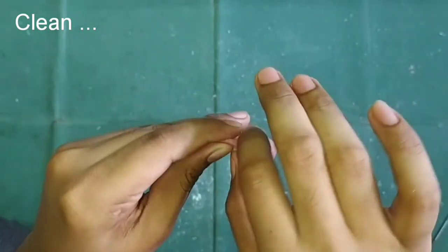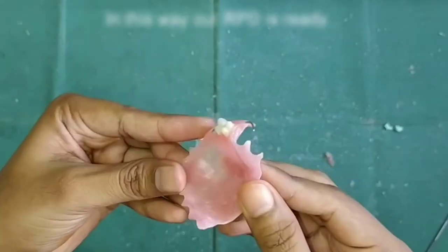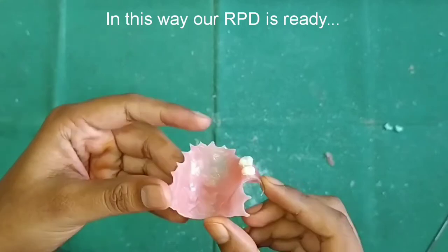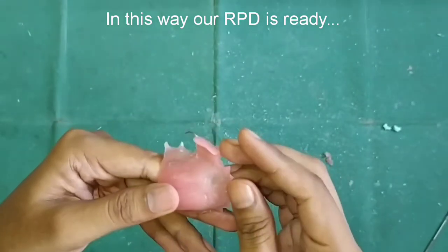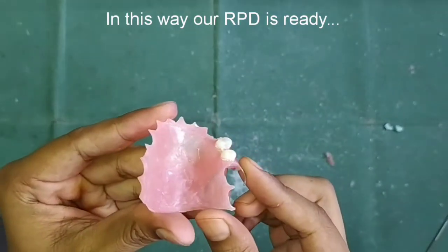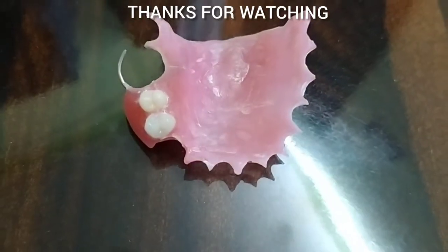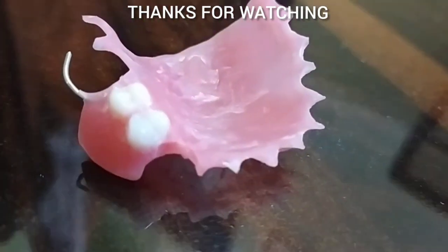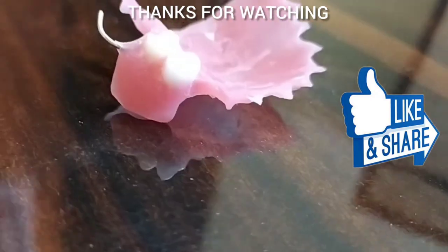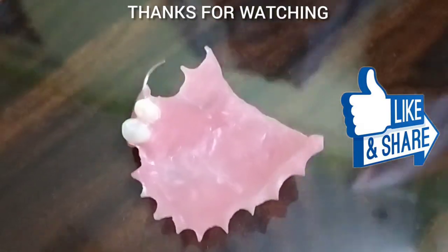Our RPD is ready. This was made on an ideal cast — you can make it on the impressions of various patients and provide it to them. Thank you everyone for watching this video. Do like the video and share it with your batchmates.